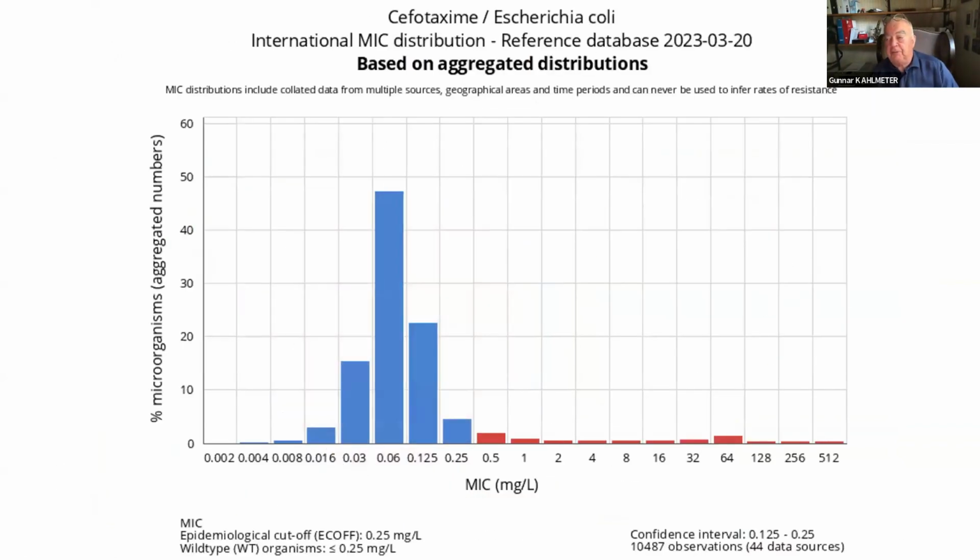So this is a good example. This is something you're all up against. It's E. coli and it's cefotaxime. And I put it to you that irrespective of where I collect E. coli in the world, they will distribute in a very similar fashion. And the blue bars will be identical. The proportion between the blue bars and the red bars will differ in different parts of the world.